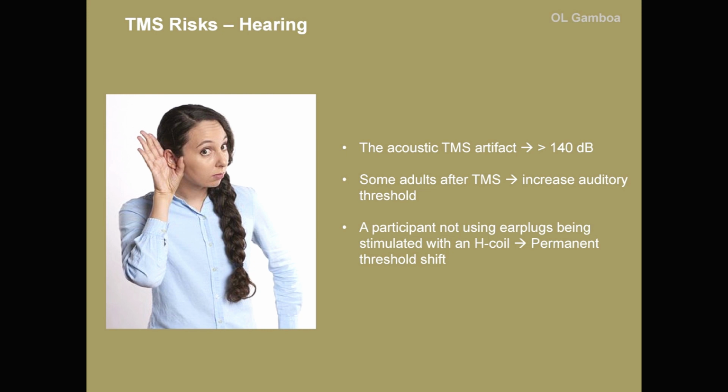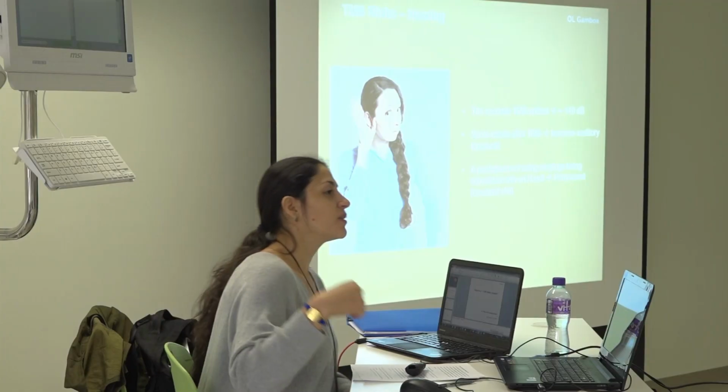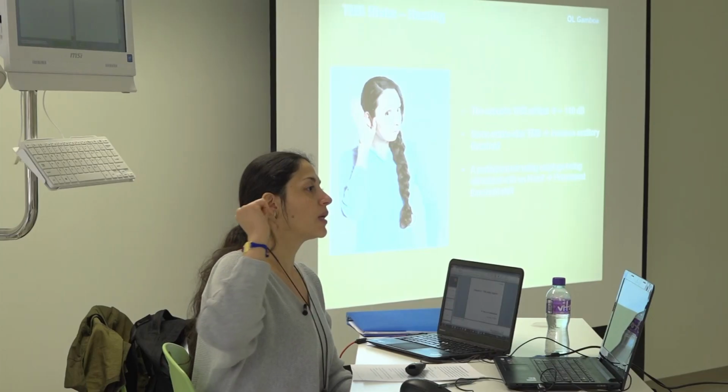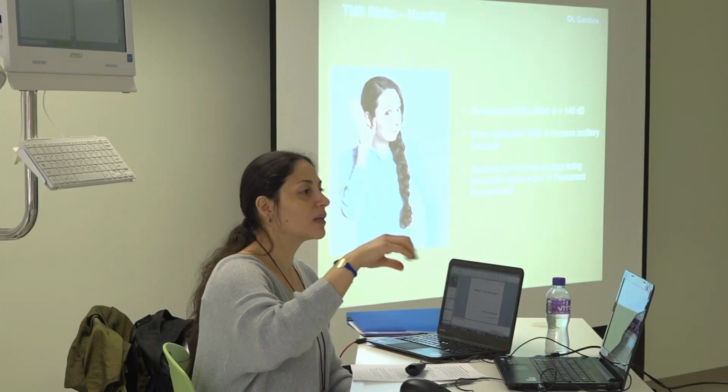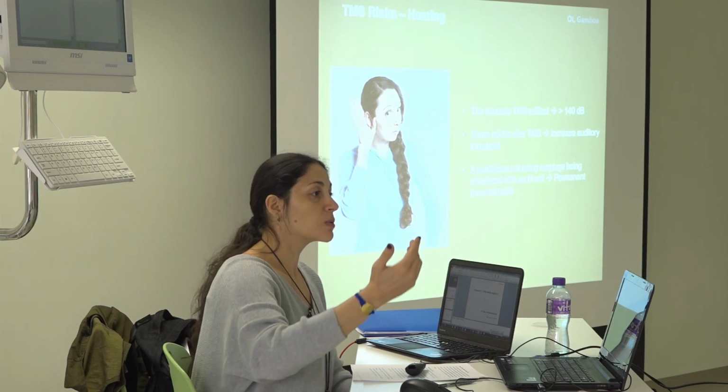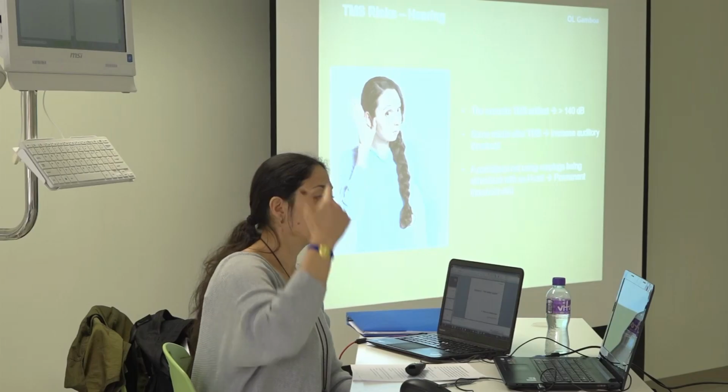As you know, the TMS makes a click. Have you heard it before? You will hear it in 30 minutes, 1 hour later. Each time you send a pulse, due to the force of the mechanism, the pulse delivers a click. If you increase the intensity, the machine output, the click will be stronger. If you are stimulating constantly, you will have this click, click, click.